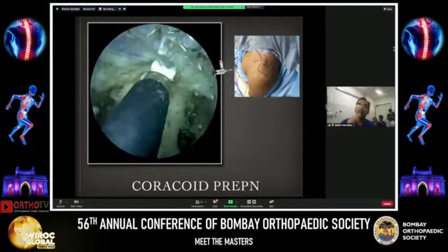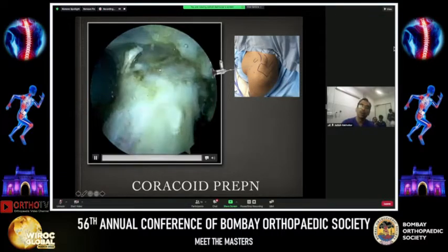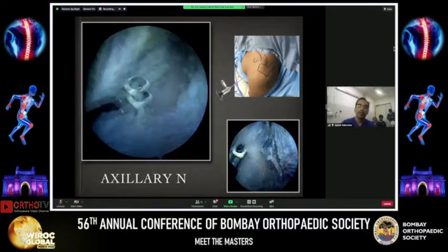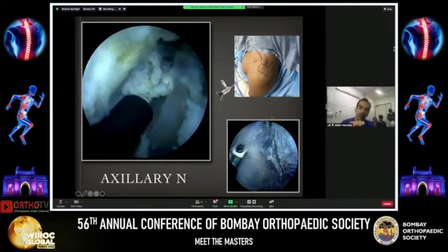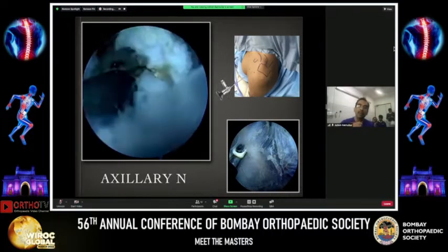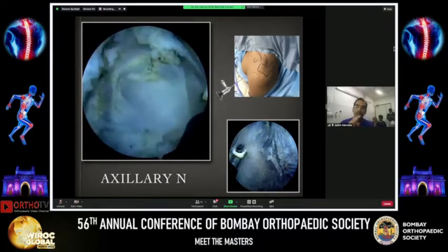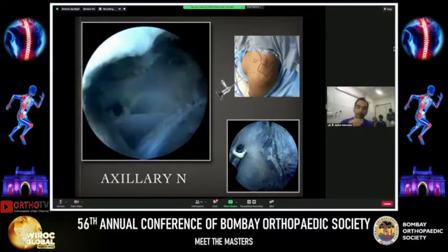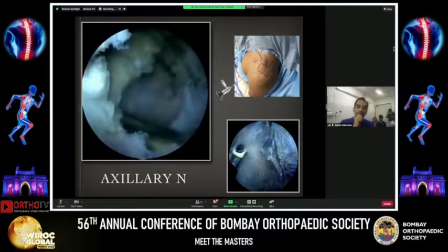We are going to clear that tissue because it gives us real estate to put in both screws. It is important not to confuse this with the conoid and trapezoid ligament, which go vertically on the top end of the coracoid. Now we come underneath the coracoid and underneath the conjoint. You can use the Vissinger rod to lift up the conjoint tendon to make space and remove the clavipectoral fascia and subscapular bursa. We are right in front of the subscapularis, and you must be able to discern between the clavipectoral fascia, the bursa, and the subscapularis.